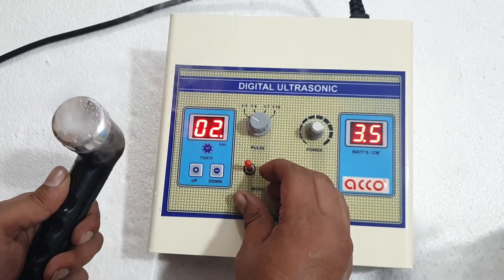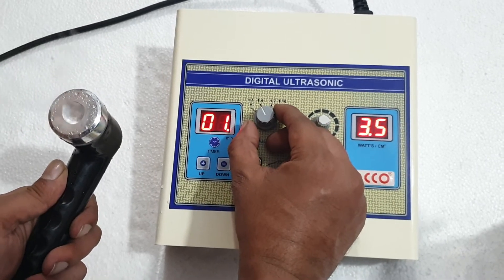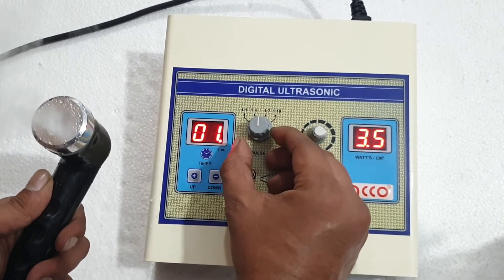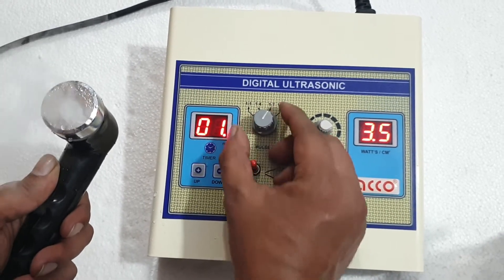Now it is on pulse mode. You can also select the ratio: 1 is to 4, 1 is to 7, or 1 is to 10.